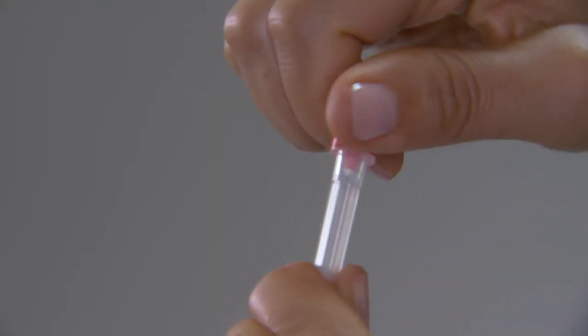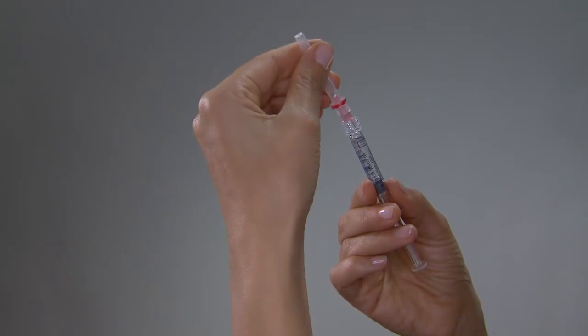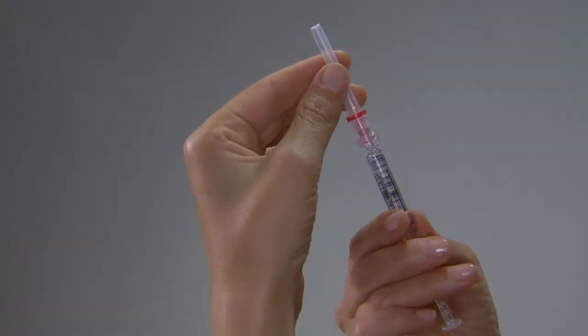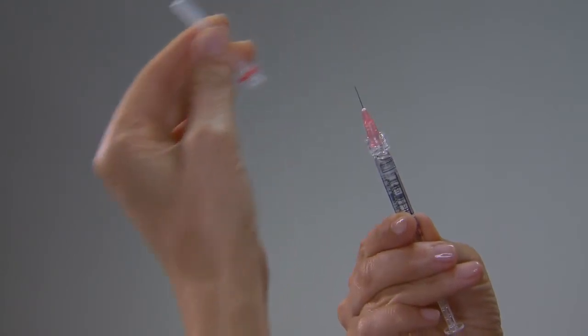Remove the safety seal cover from the 29 gauge 1/2 inch red needle. Twist the needle onto the pre-filled syringe until it is tightened, being careful to keep the protective cap in place. Holding the barrel of the pre-filled syringe, carefully remove the needle cap.